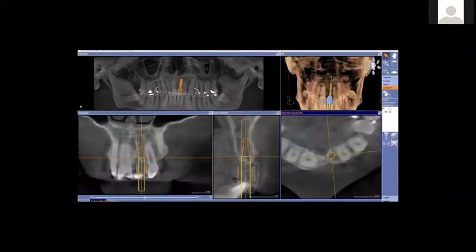All right, so here's the CT treatment planning in Galileos, once the CEREC optical scan and the optical design of the virtual restoration has been merged. And in this case, we sent this to CCAT for the fabrication of an optic guide. This can be done with a CEREC guide too nowadays. It can be done with a digital guide. It can be done with all sorts of guides. Probably this case would be the easiest to be done with a CEREC guide too these days. There's not much scatter, and you can certainly mill or print these guides in the office to do them yourself.